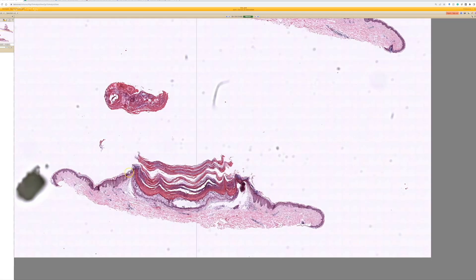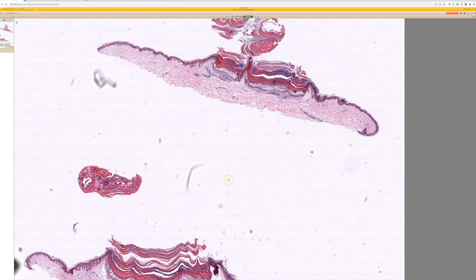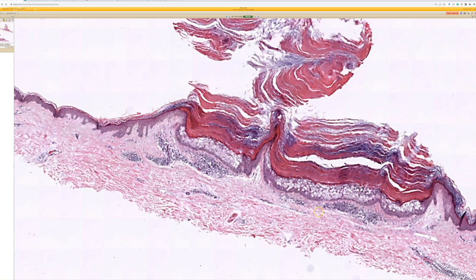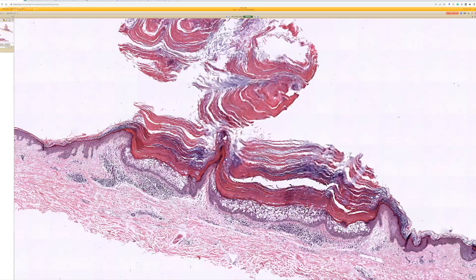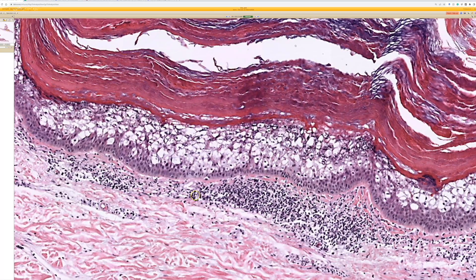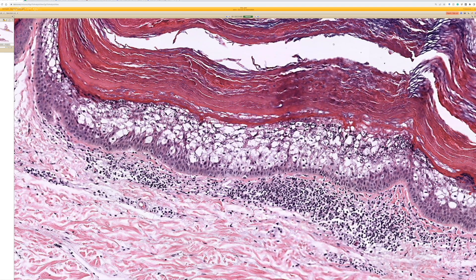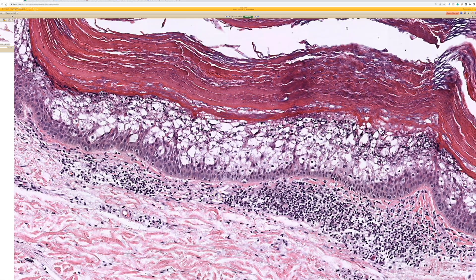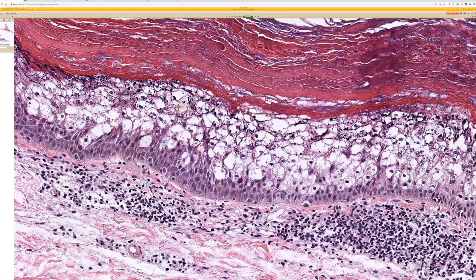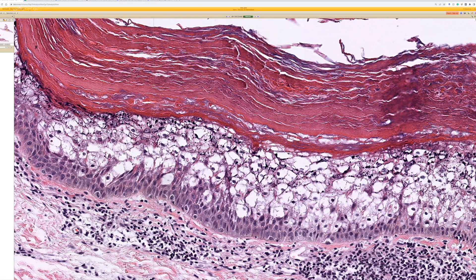We've got a single solitary lesion — clinically they thought it was probably a seborrheic keratosis or a wart. Microscopically we see a horn over top of it; we could add this as a fifth thing that could make a horn on our list of cutaneous horn. But what is this pattern called right here? Epidermolytic hyperkeratosis — EHK.